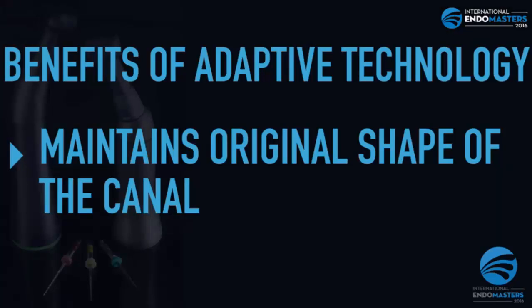Benefits of the adaptive technology: maintains the original shape of the canal. This is a lower canine with two roots. I used a small sequence of the TF adaptive to shape the canals. You can see there's a two-rooted lower canine.